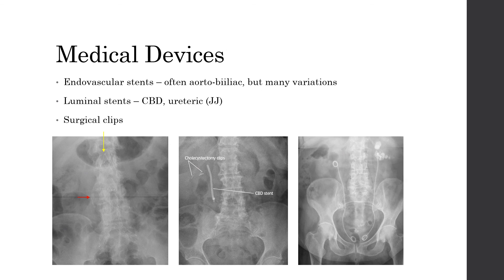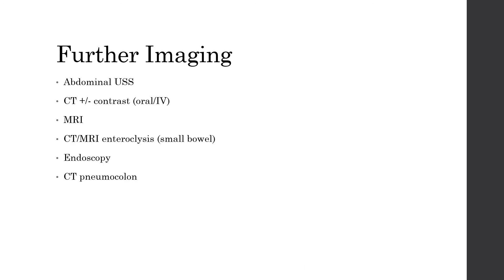We can also identify some medical devices as incidental findings on abdo x-ray. On the left hand image we have an aortobioiliac stent signified by the yellow arrow, and we can see the reason why it was put in with the red arrow, which shows the calcified brim of a AAA. In the middle, we have a CBD stent put in for biliary obstruction and also cholecystectomy clips — surgical clips are a common finding and suggest a recent procedure in that area. On the right we have two ureteric JJ stents, so called because both ends look like the hook of a J. Further imaging options are available and here is a list of things that can be considered to further investigate any pathology identified.